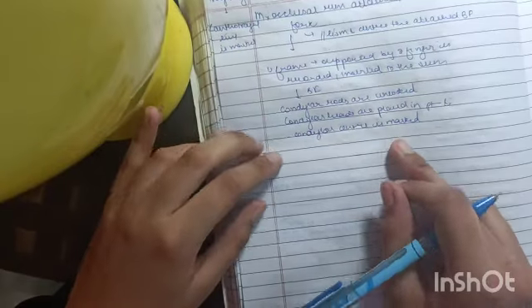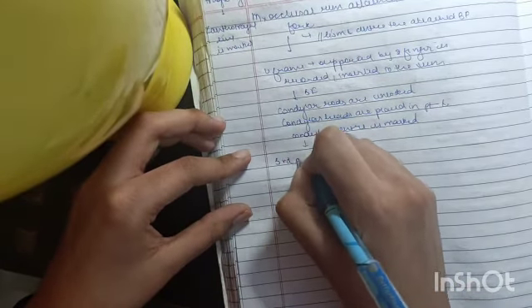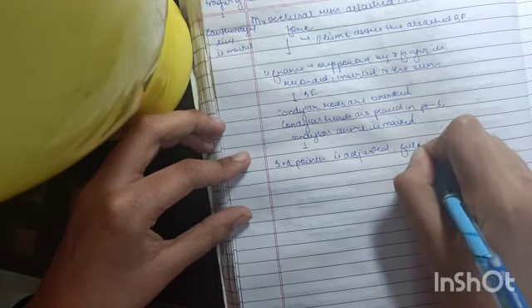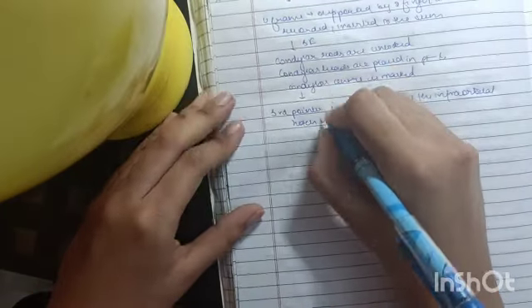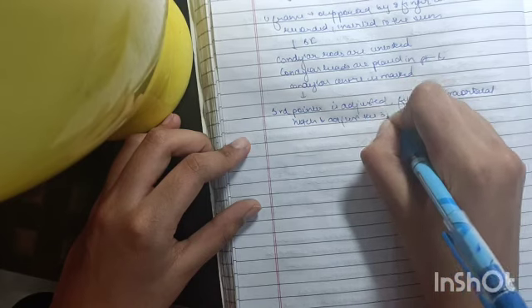After unlocking the condylar rod, now we will use the third pointer, that is the orbital pointer. So the third pointer is adjusted. First of all, we will feel the infraorbital notch, and then we will adjust the third pointer accordingly.